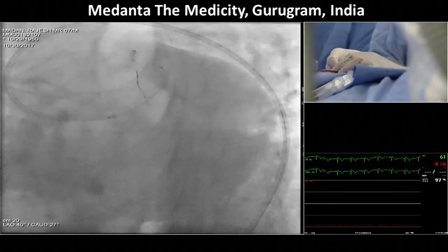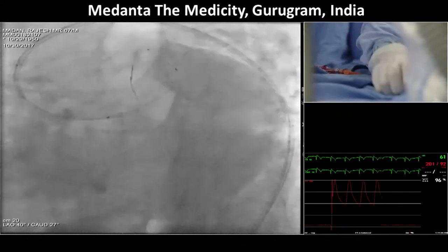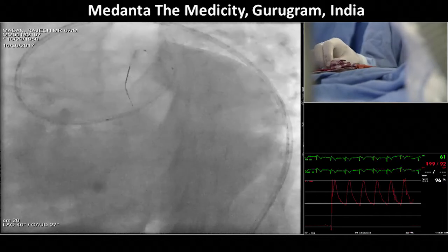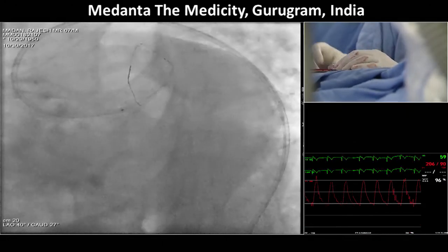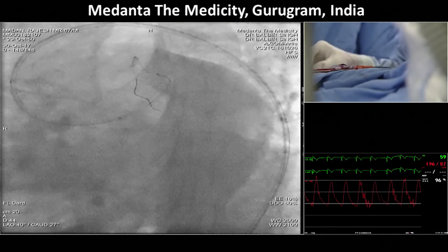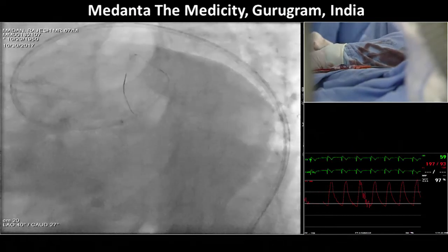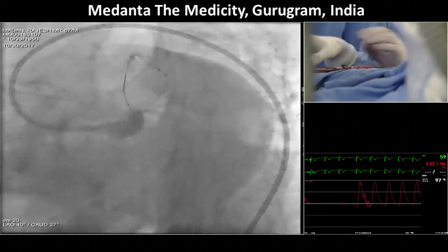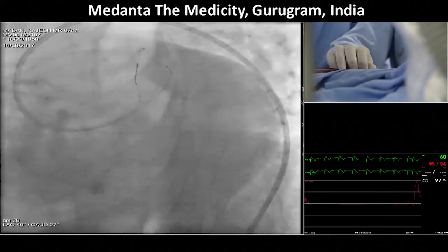I just want to give a short comment regarding the use of a small balloon or a short balloon for flaring in the ostium. Normally in my practice, before we pull the balloon out of the coronary catheter, while the balloon is half deflated, I introduce the guiding catheter into the left main.